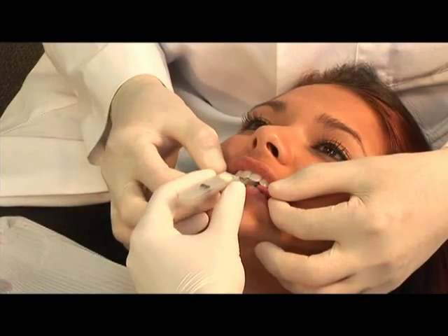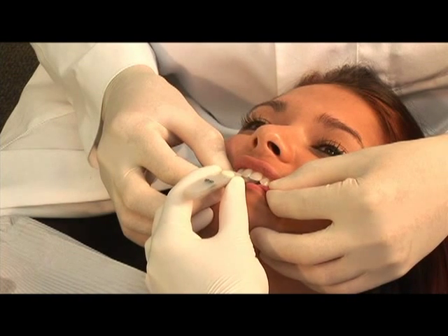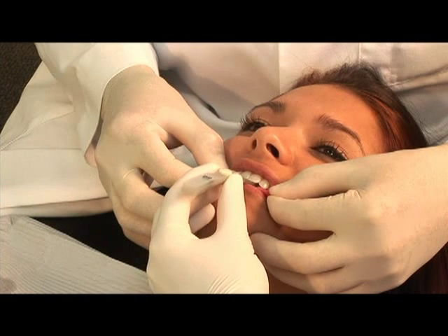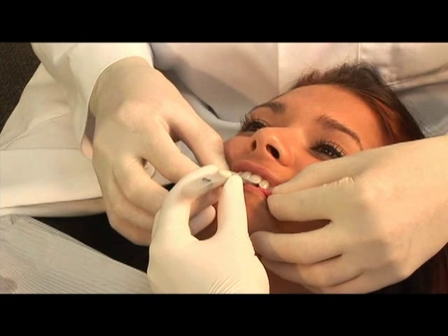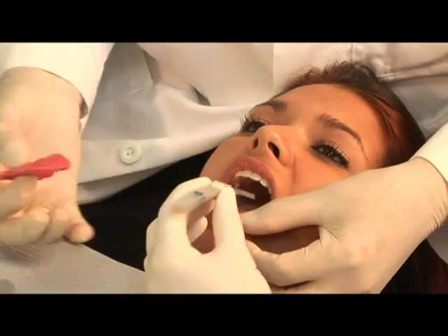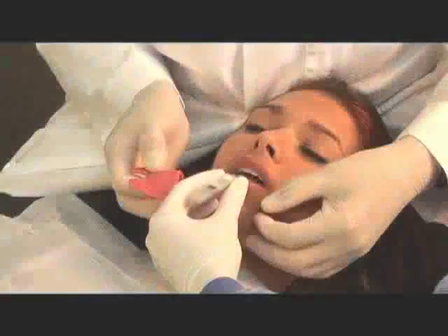Continue to hold together. Now just barely open, close, barely open, close, open all the way now. Stay open there for us. Relax. Open for me.